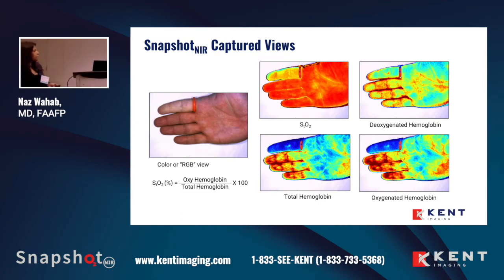I put this up for two reasons. One is that this is something immediate that you can see. We'll actually do a demonstration today for you guys to evaluate that. If you put a tourniquet on the finger, you will see up to 4 different images, depending on how you look at the interface. Here you have the oxygenated blood, the oxygenation percentage, the total hemoglobin, the oxygenated hemoglobin, and then you can break that down even further to the deoxygenated hemoglobin.